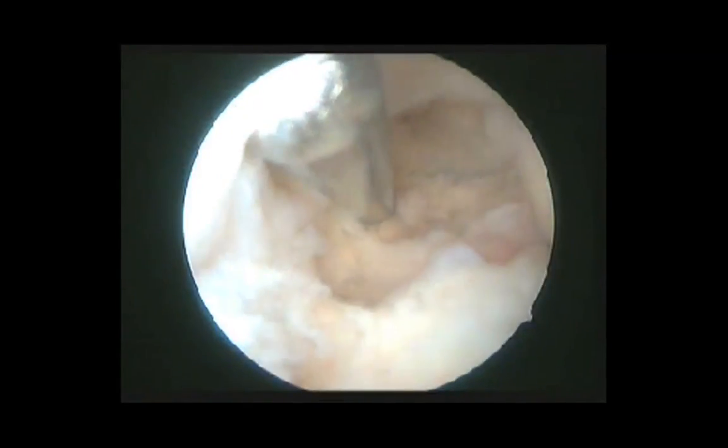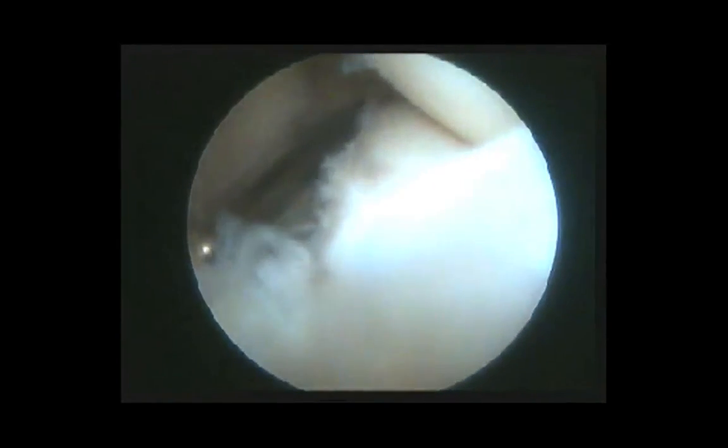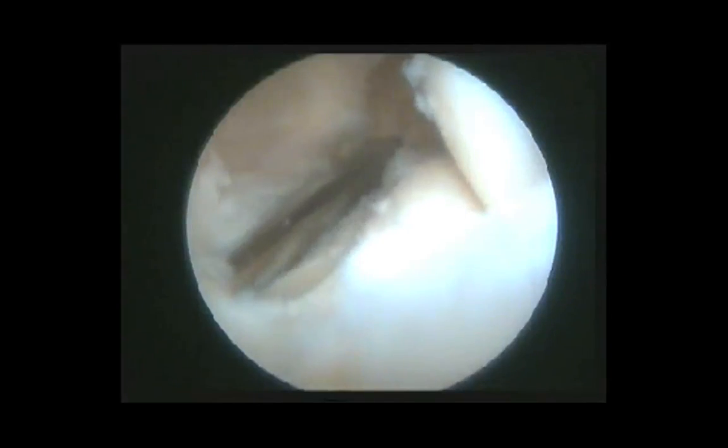Now the scope is viewing from the posterior medial portal and the shaver comes in from the posterior lateral portal. We are taking down the last remnants of the cyst wall that are attached to the posterior capsule and along the inferior posterior surface of the tibial condyles. The shaver is to be used very cautiously when directed towards the posterior surface, because over-enthusiastic debridement can result in injury to the neurovascular bundle. This is the beauty of arthroscopic debridement — you can actually take care of all the compartments.